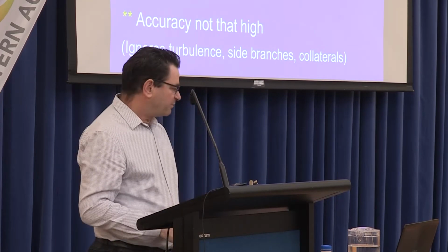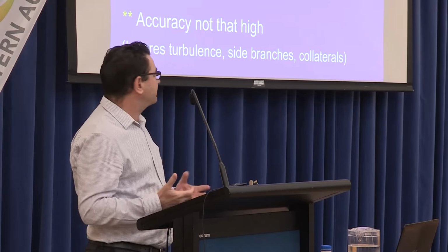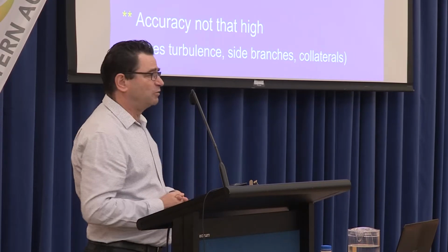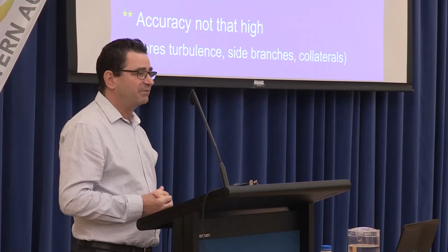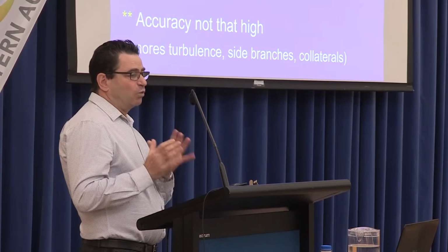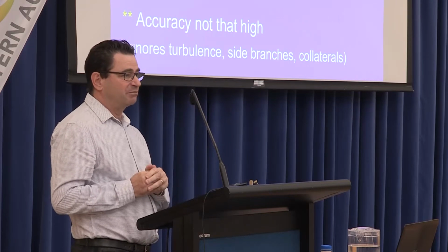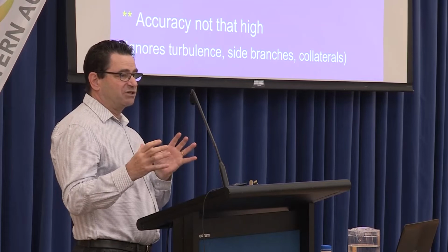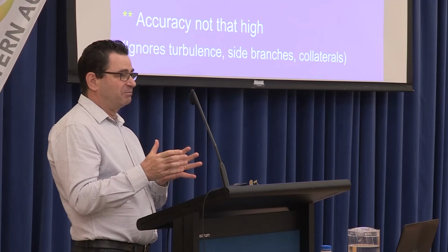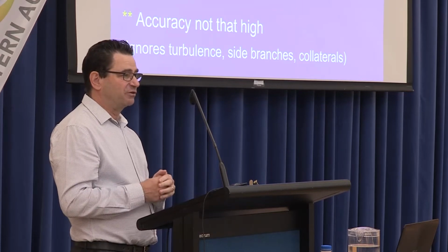So, on that note, again, I don't want to go too complex, but the whole principle about arterial Doppler is that we can accurately measure the velocity of blood in a blood vessel. Now, flow is related to the cross-sectional area of the blood vessel times the velocity. So that's how much blood flow is going through there.